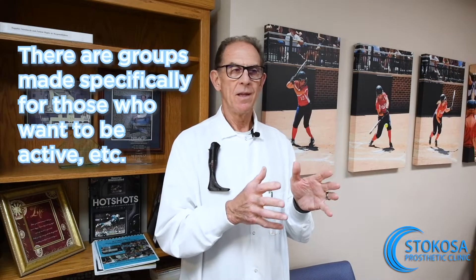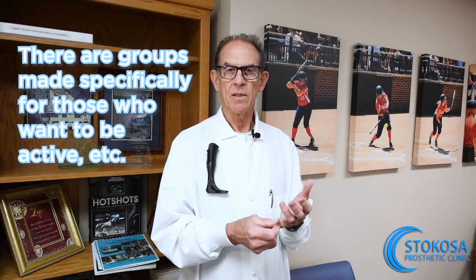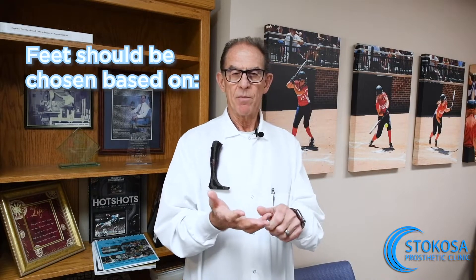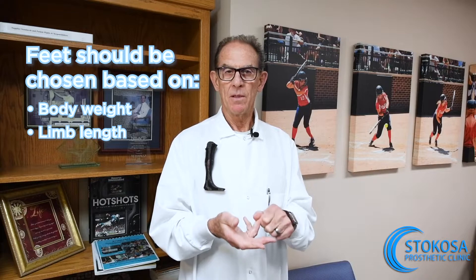There could be 20, 30, or 40 feet that are made specifically for people that want to be active — like running, playing basketball, baseball, frisbee, or jogging. So we'll take those particular feet based on your body weight and the limb length.